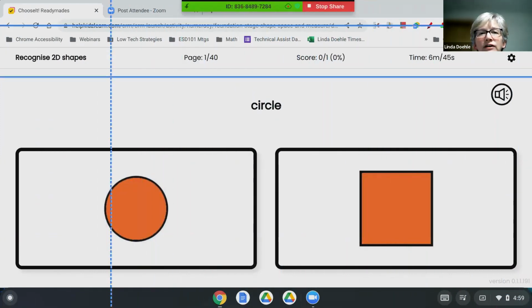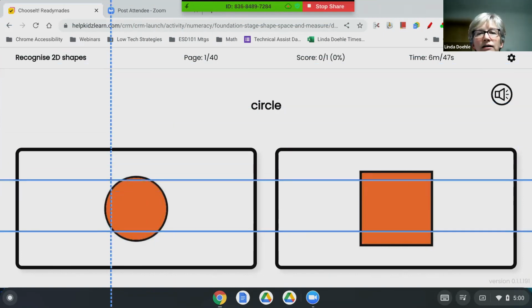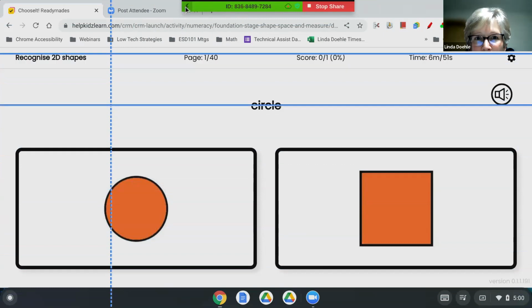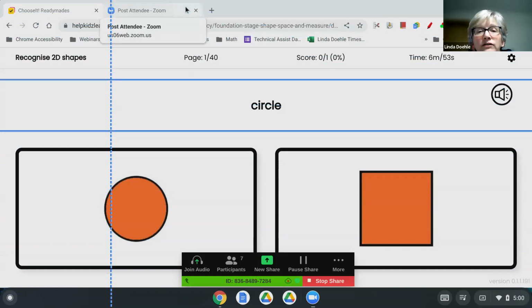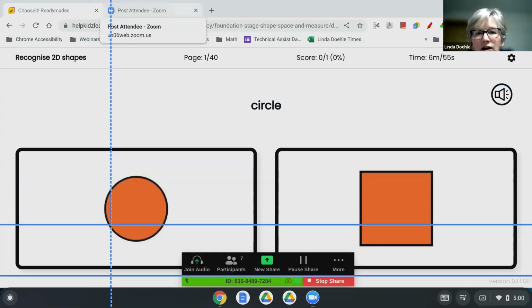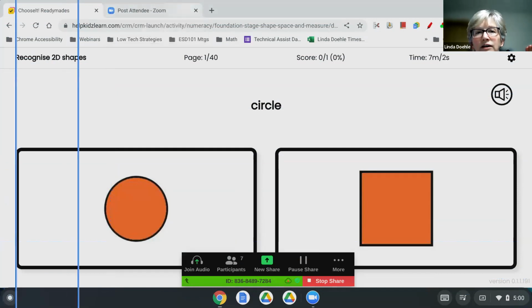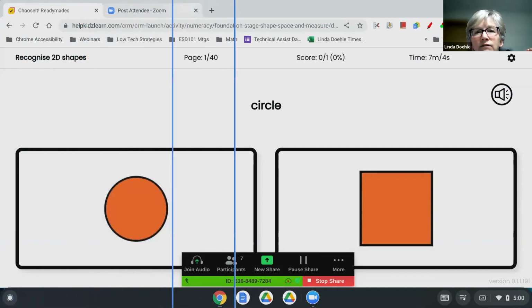I'm actually gonna go ahead and go back up here. Oh, you know what? Just a second. Sorry, I'm gonna stop this. I can just stop it anywhere, because I want to start a whole new scan. And so at this point, I can do that.